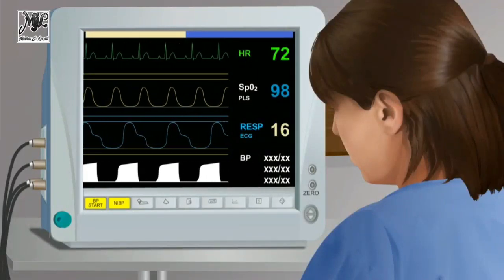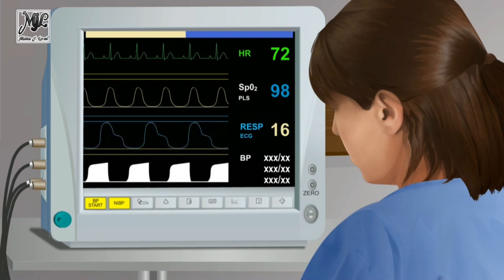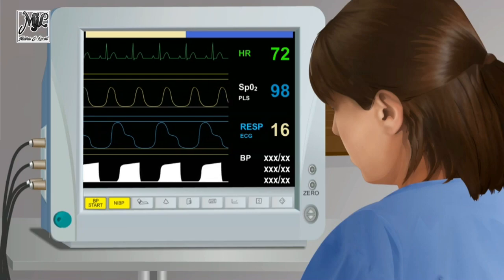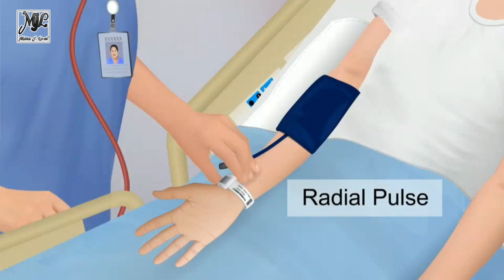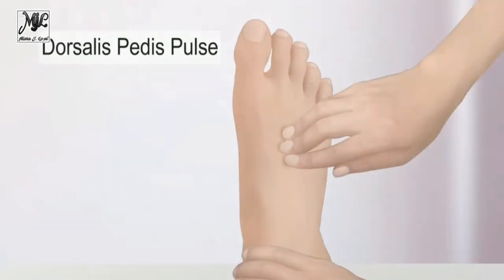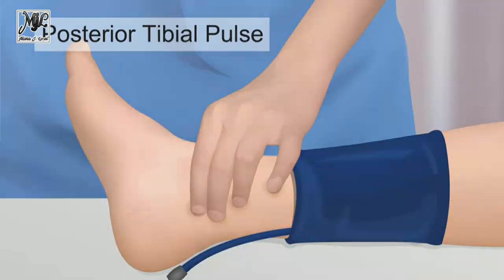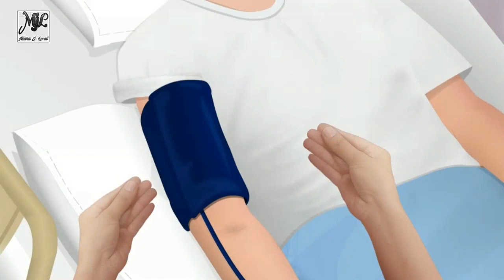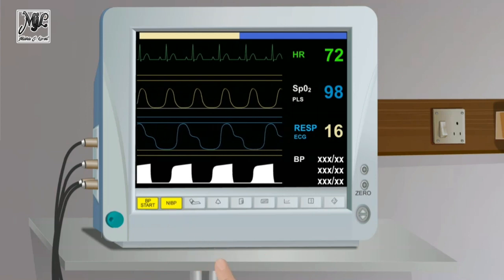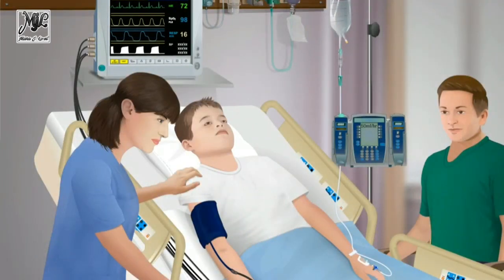To obtain a blood pressure value with an oscillometric device, adjust the settings to a mode appropriate for the child's size and type of cuff, if the device allows. Palpate the appropriate artery — brachial or radial in the arm, or popliteal, dorsalis pedis, or posterior tibial in the leg — and place the cuff so the midline of the bladder is over the arterial pulsation. Wrap and secure the cuff snugly around the bare extremity, then activate the oscillometric device to initiate the BP measurement. Stabilize the child's extremity to limit movement.